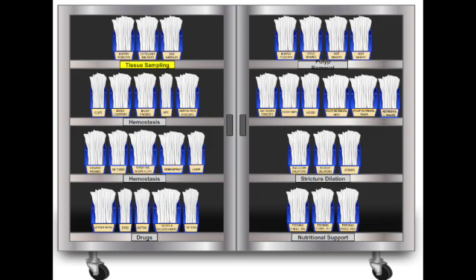Before we move to energy devices, you mentioned a specific tool for really bad variceal bleeding. Oh, right. The Sengstaken-Blakemore tube. This is really a stabilization tool for catastrophic variceal bleeding when the usual endoscopic methods, the banding or injection, just aren't working or can't be done quickly enough.